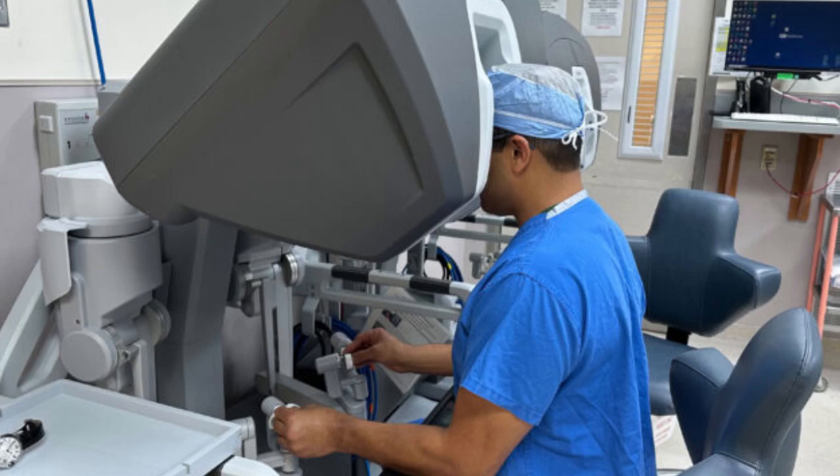For this robotic liver transplant, the surgeons operated through several half-inch keyhole incisions and made a single 6-inch vertical incision between the abdominal muscles for removing the diseased organ and placing the new liver, which is about the size of a football, inside the abdomen. This incision is considerably smaller than the one used traditionally and does not require cutting through abdominal muscles, enabling a faster recovery.